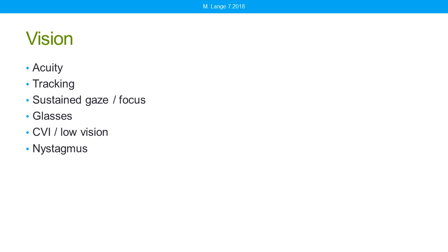So you could check with Tobii Dynavox to see if they have a recommended starting distance, but mine varies a bit. And it really does depend on where the client can best see the device and where their movements are captured. And not just captured, but where they can reach all areas of the display using their eyes. So, of course, if that camera was really, really close, it wouldn't allow the client to look at all of the device accurately. It would only capture perhaps the middle of the device.